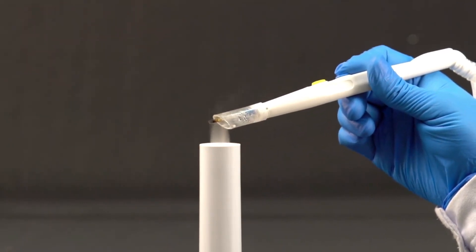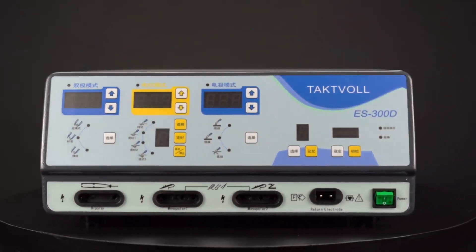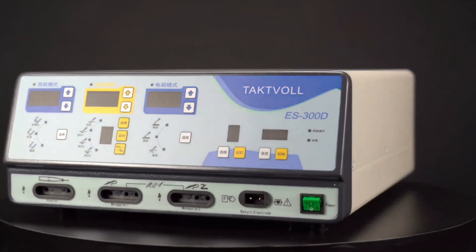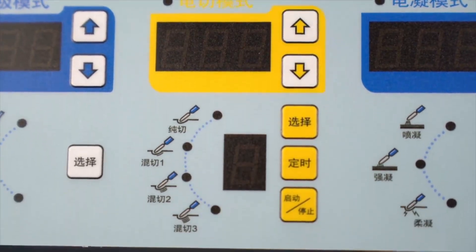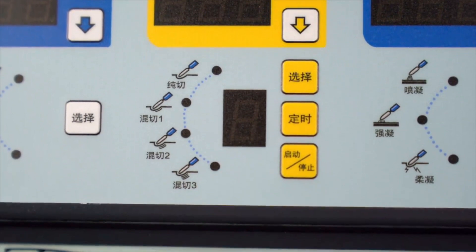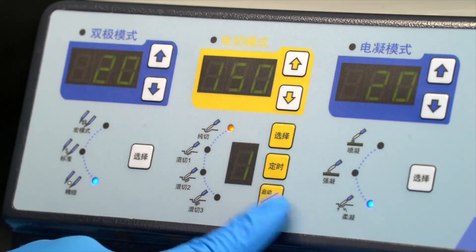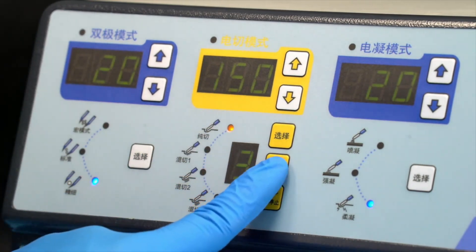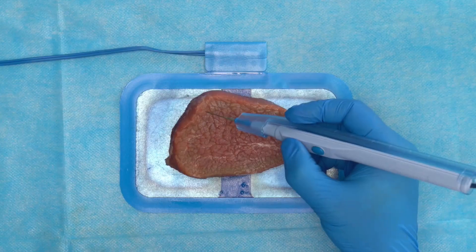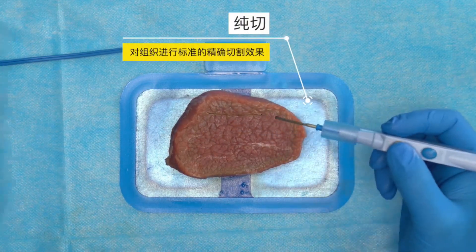Now we will show the different performances of the TactFall S300D under different functions. In monopolar mode, the S300D has four cutting modes: pure cutting and three blend cutting modes. We push the buttons to switch the cutting mode and power settings. The pure cutting mode can perform standard and precise cutting effects on the tissue.